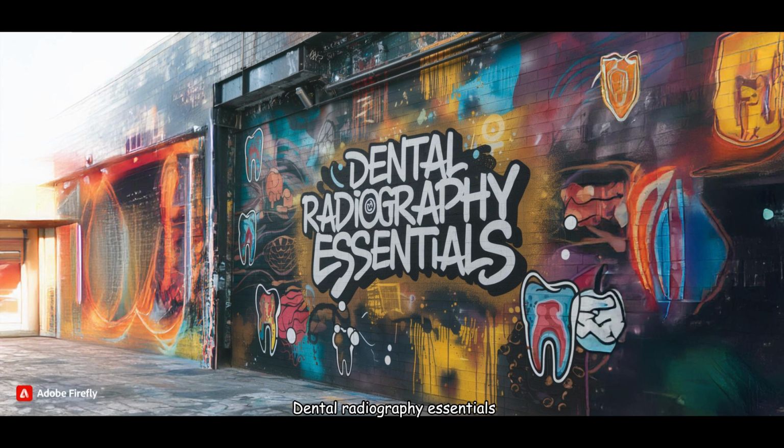Dental Radiography Essentials. In the realm of dentistry, dental radiography plays a pivotal role in diagnosing and treatment planning for various oral health conditions. The ability to visualize structures hidden beneath the surface allows dental professionals to identify issues like cavities, bone loss, and impacted teeth that may not be readily apparent during a clinical examination.